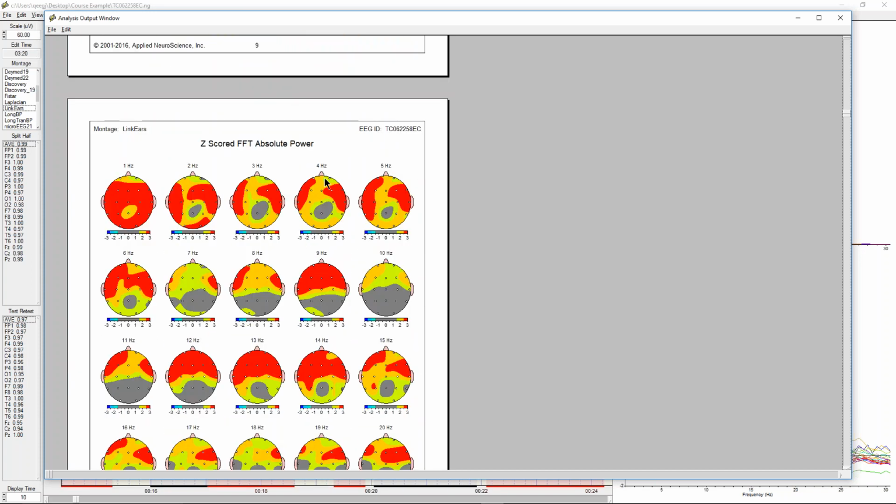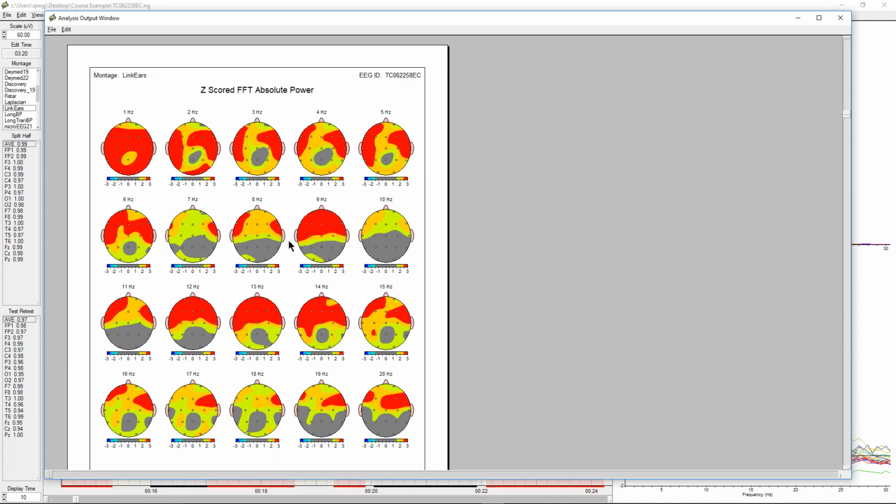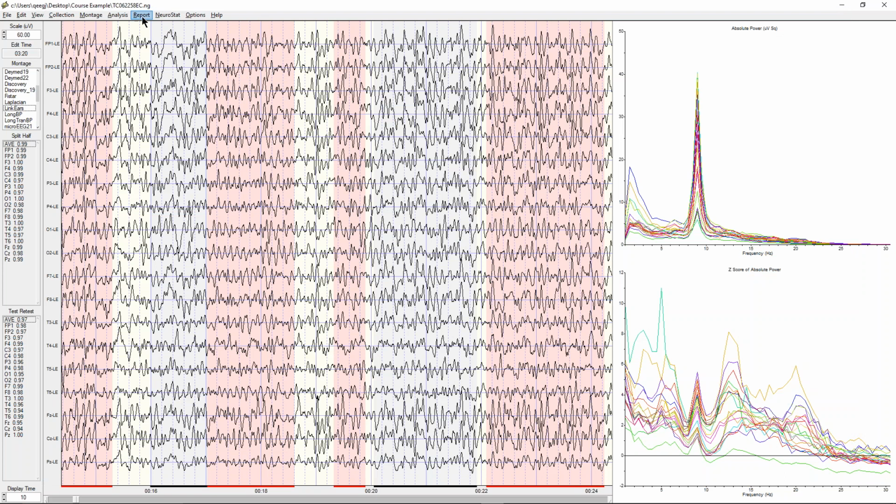So then we go to the statistical maps, and the statistical maps are set so the blue value is -3 standard deviations, the red value is somewhere between 2.5 and 3 standard deviations. So the colors start at 1.5 standard deviations. Now we could change that, and in fact it probably would be useful to change that.